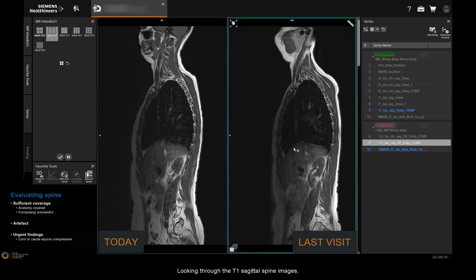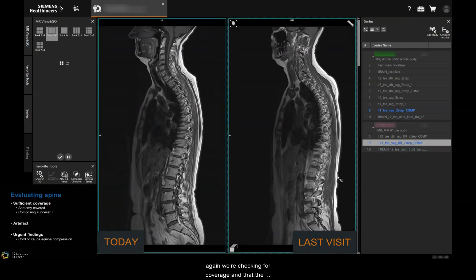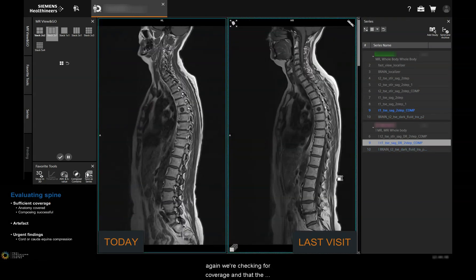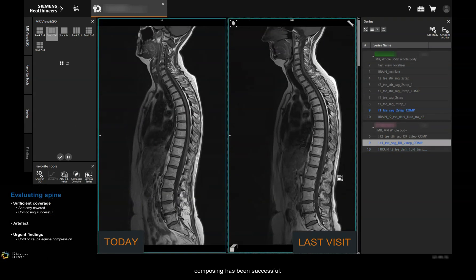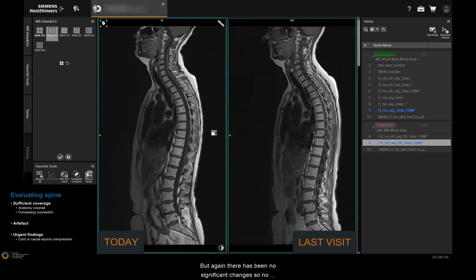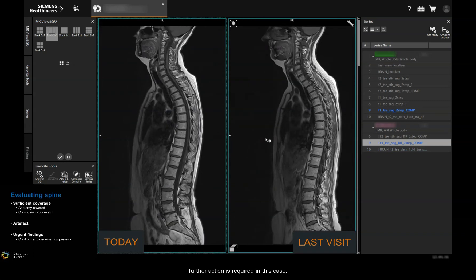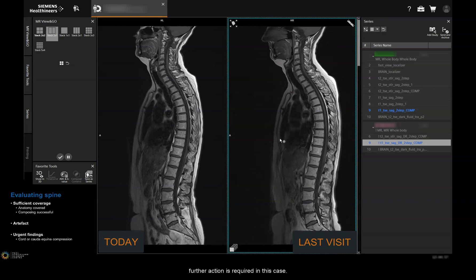Looking through the T1 sagittal spine images, we're checking for coverage and that the composing has been successful. There have been no significant changes, so no further action is required in this case.